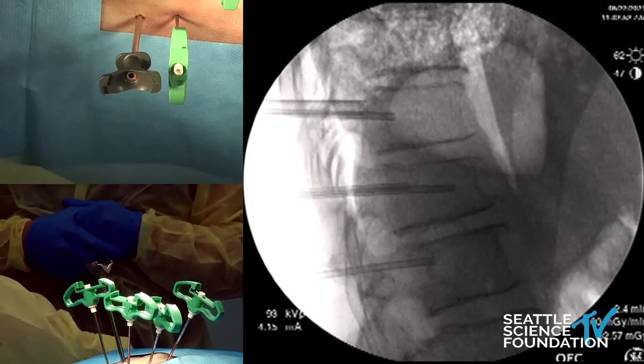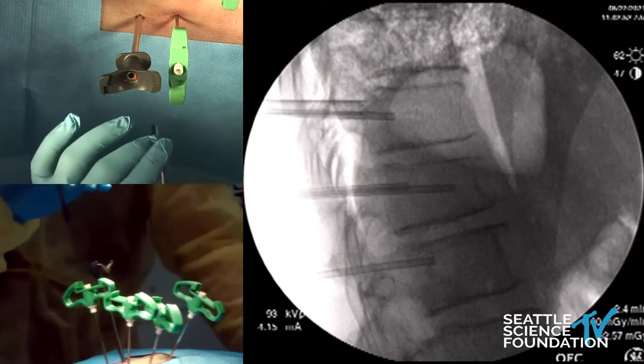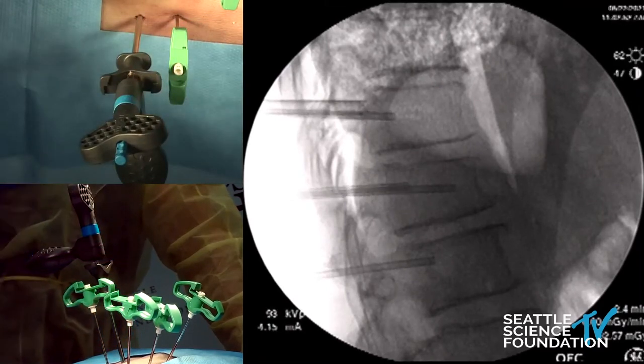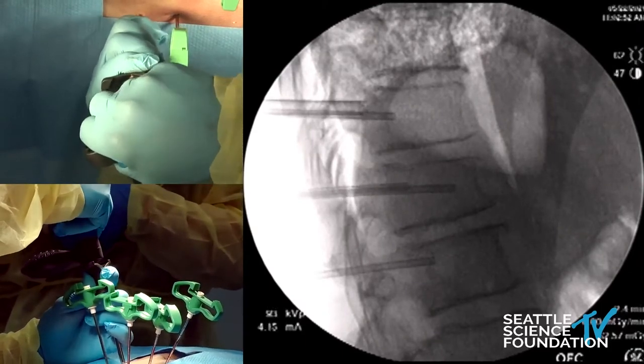Now we have a nice trajectory for this spine jack to go in. We would use this in one of your very kyphotic compression fractures where there's a lot of collapse, and we want to bring those end plates back up into a more anatomic position.